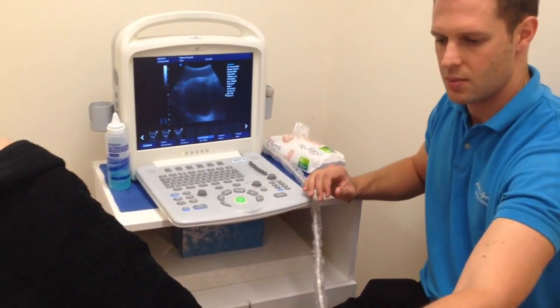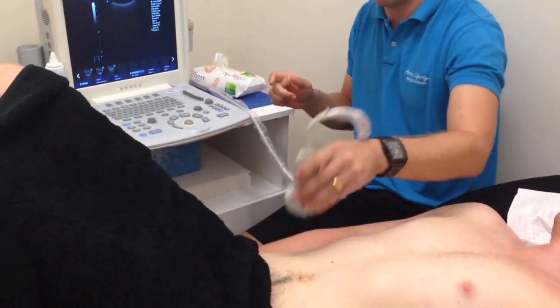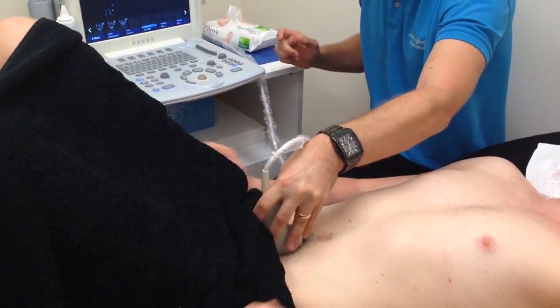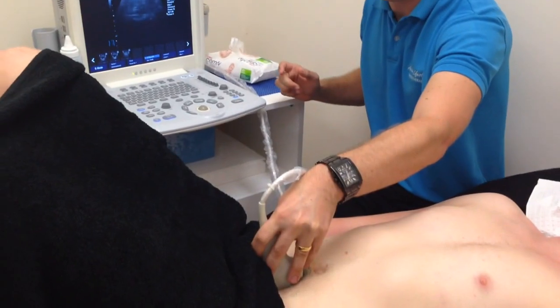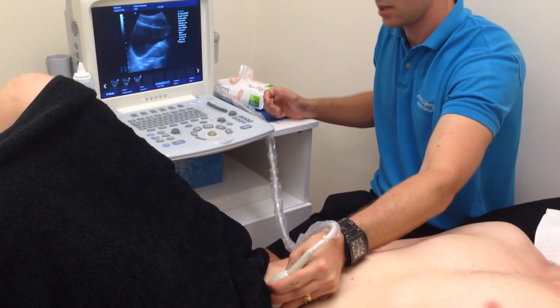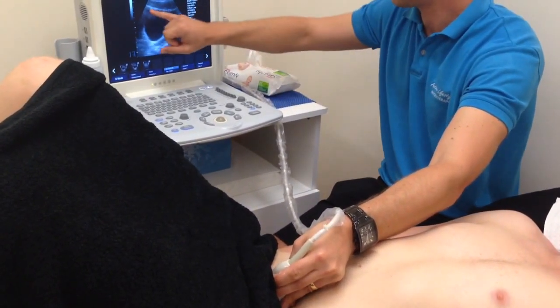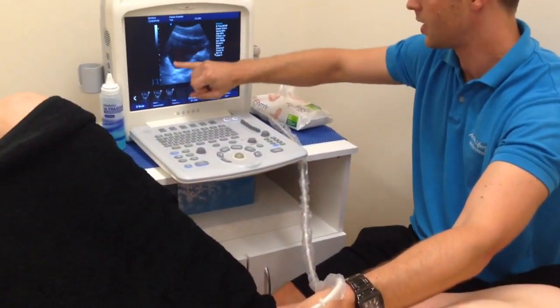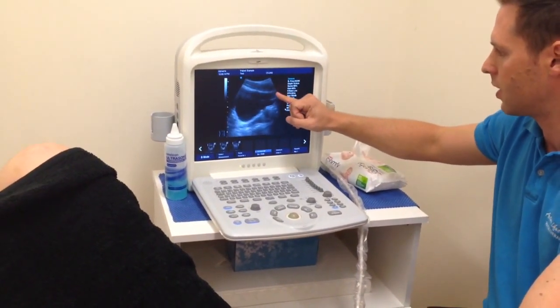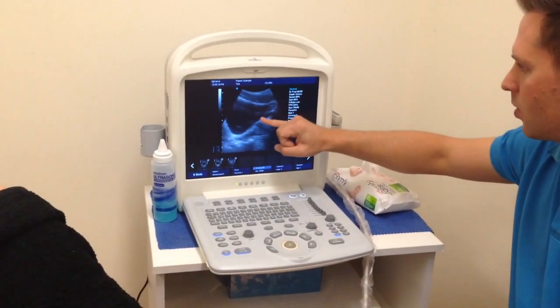The next image we're going to look at for the pelvic floor is the sagittal orientation — mid-sagittal line — with the dot on the probe facing the patient's head. We come down to the top of the pubic bone, and here we're visualising the bladder in the sagittal plane. What we're looking at here is the neck of the bladder and the posterior wall down here.